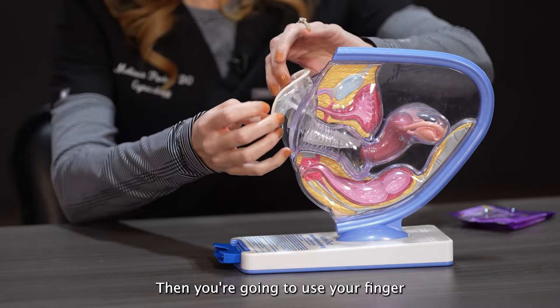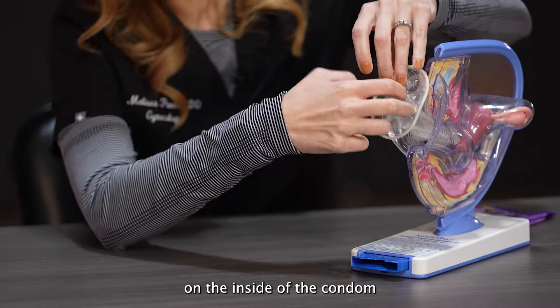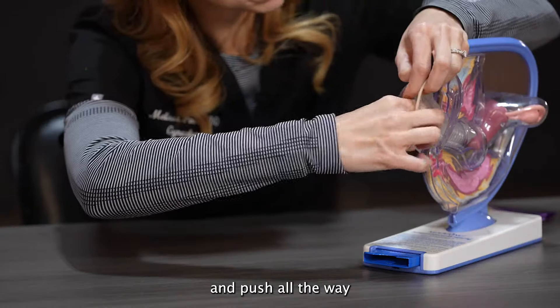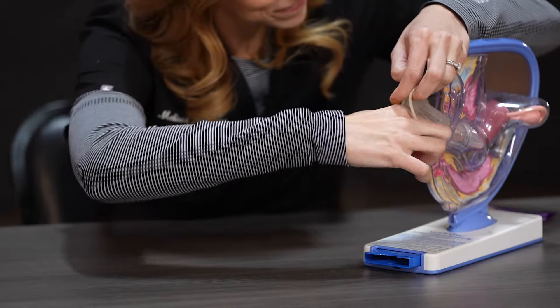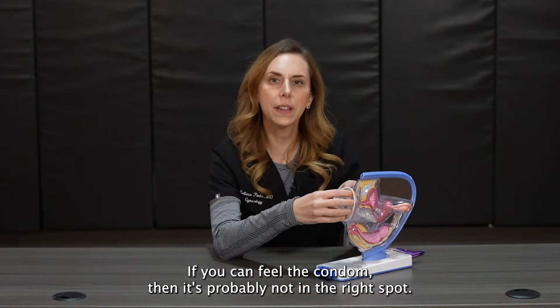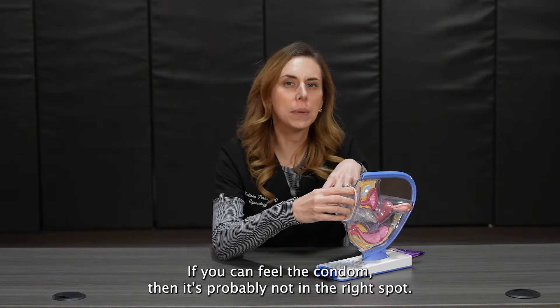Then you're going to use your finger on the inside of the condom and push all the way until it opens up. If you can feel the condom, then it's probably not in the right spot. Once the condom opens up at the top, it should be comfortable.